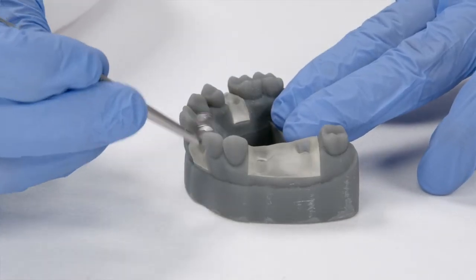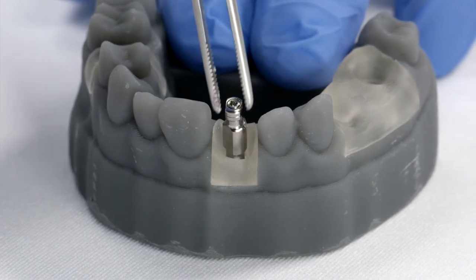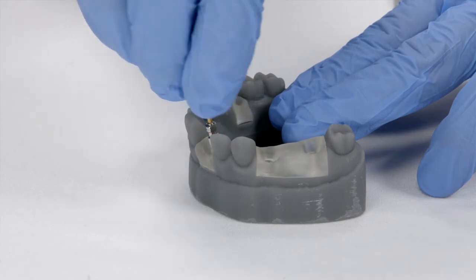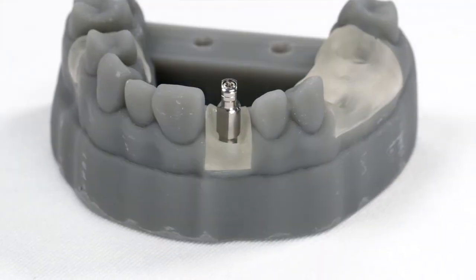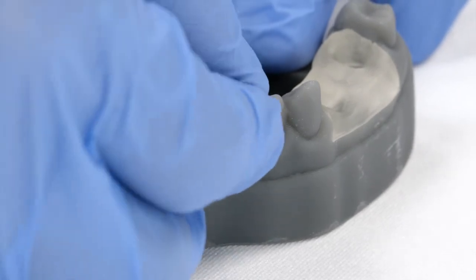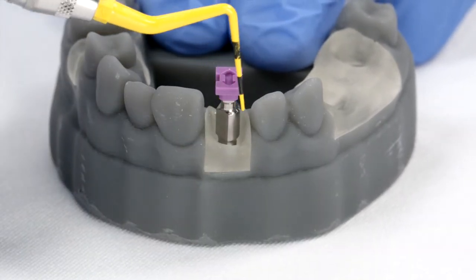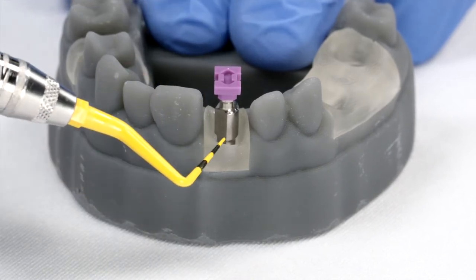This is a long impression coping. The goal here is to find the right position and screw all the way with the plastic cap. It's time to go deep to show the difference in height with the short and long one.